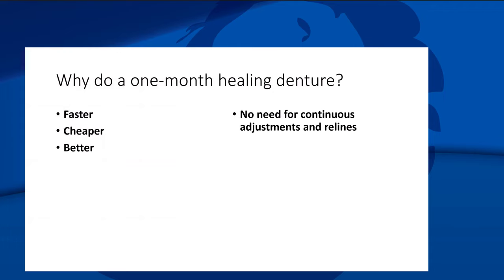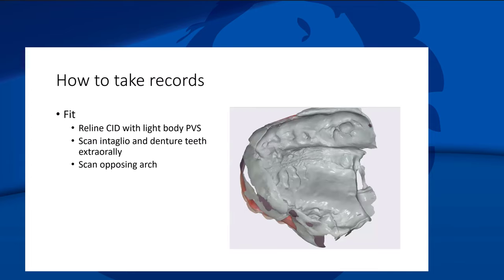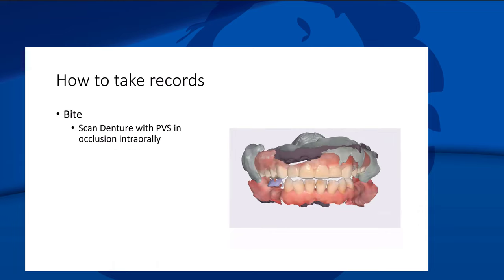Taking records is just so easy. All we have to do is reline the immediate denture with some light-body PVS, scan the intaglio and the denture teeth extra-orally, scan the opposing arch, and take an intraoral bite to get all the jaw relations perfectly. From there I can make a denture.